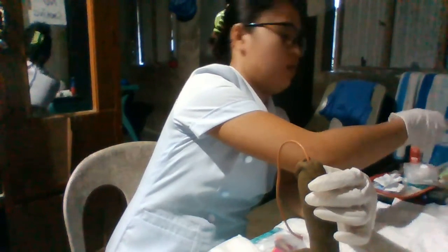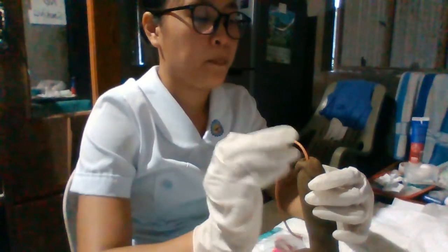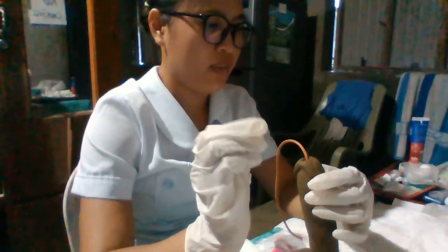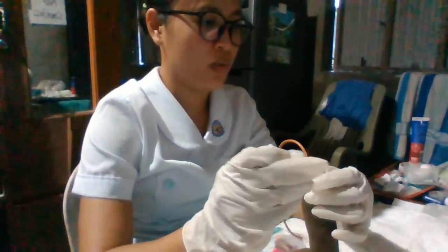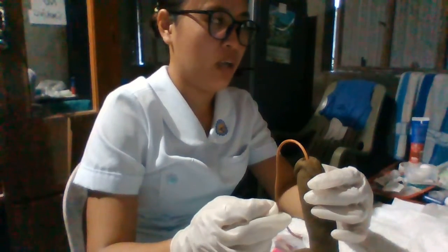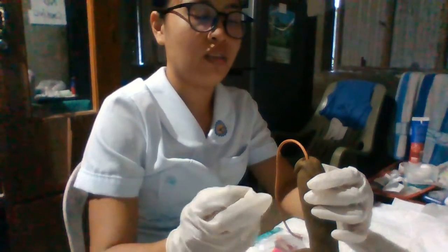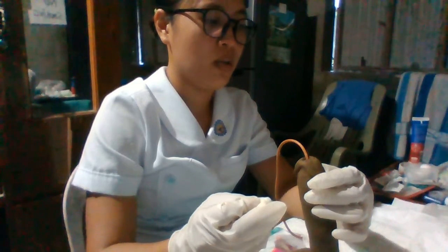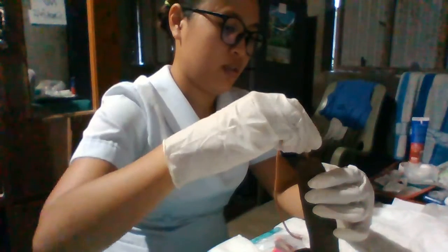Then next, we have to get new cotton balls to wipe the length of the catheter in circular motion, along 10 centimeters or 4 inches.